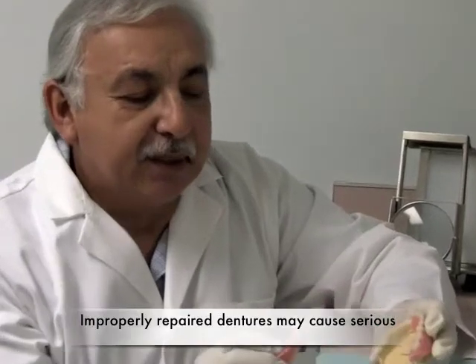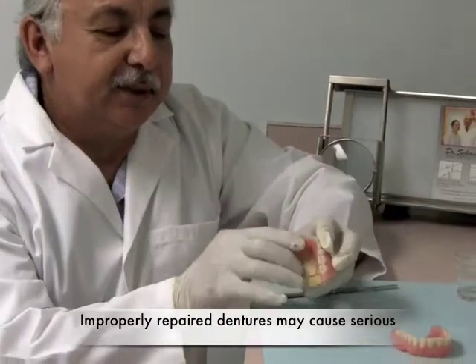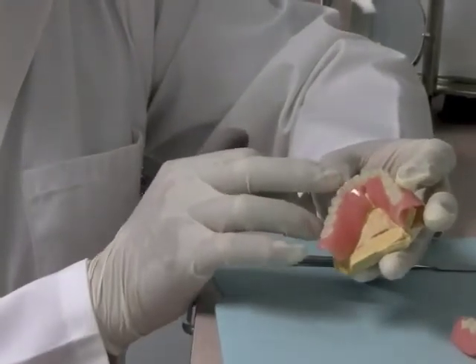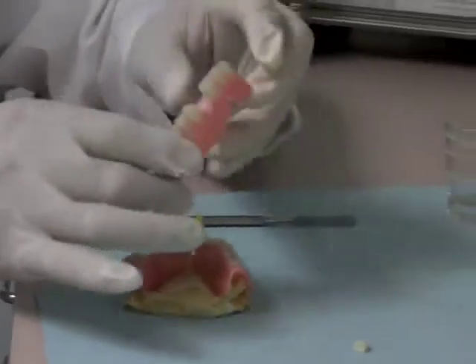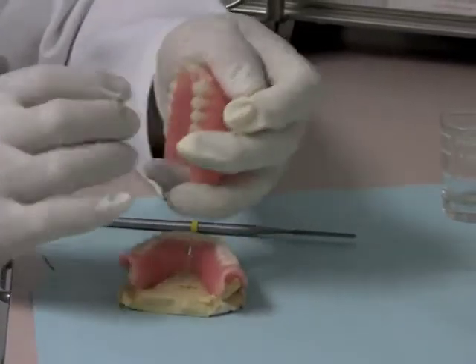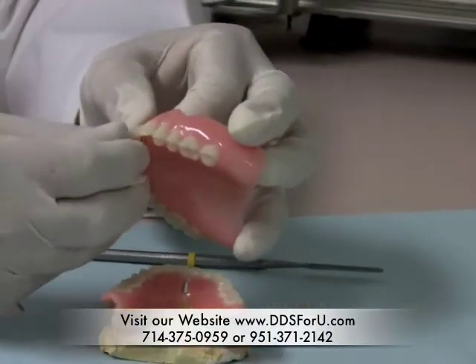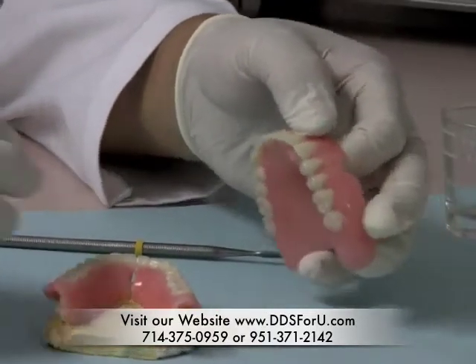First of all, I have to grind the denture so the material will flow in there, and I make sure that the denture is positioned correctly, and there's actually acrylic that's been ground away so the material can flow into. The same thing here with the tooth repair, is that the acrylic has to have a place to flow into, and we have to make sure that the tooth that we're going to replace fits perfectly in there.